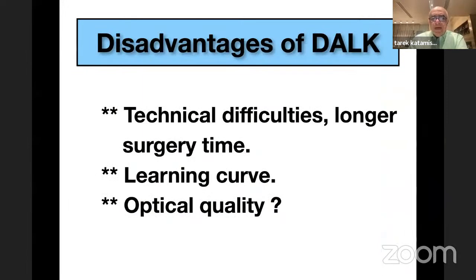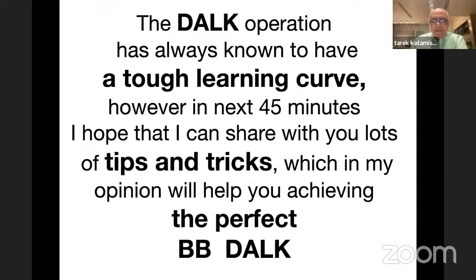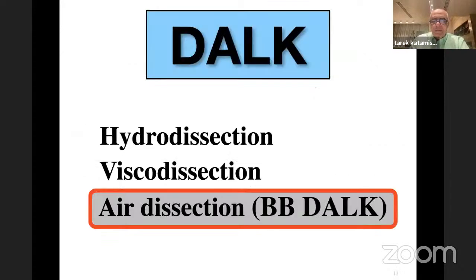The disadvantages of DALK are sometimes technical difficulties and longer surgery time. But as I always say, the DALK operation is known to have a tough learning curve. However, in the next 45 minutes, I hope that I can share with you lots of tips and tricks which, in my opinion, will help you achieve the perfect big bubble DALK.